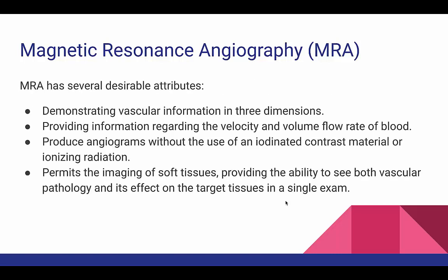So why would someone use MRA specifically instead of the other techniques? With MRA, what we have is that it demonstrates vascular information in 3 dimensions. It provides us with information regarding the velocity and volume flow rate of the blood.